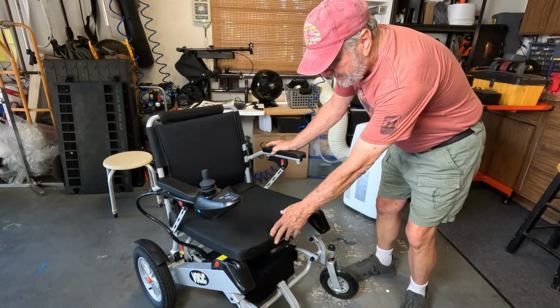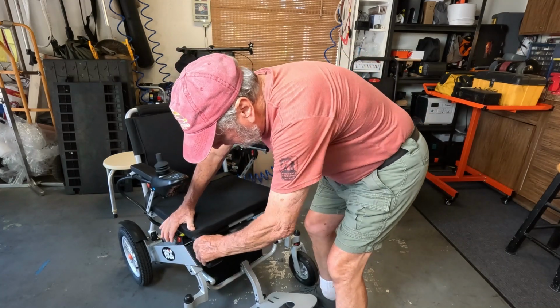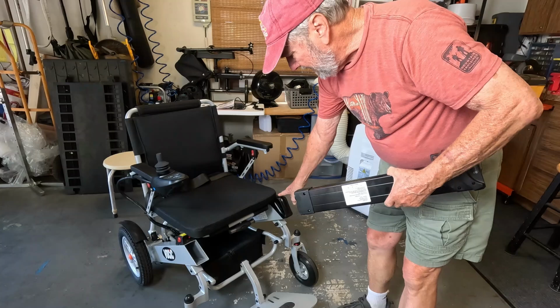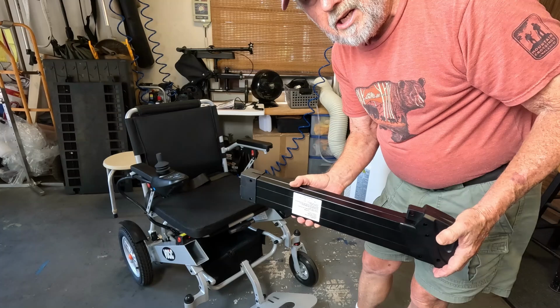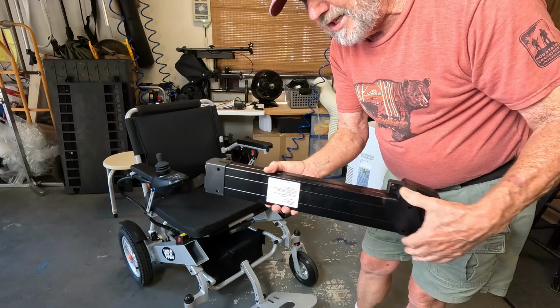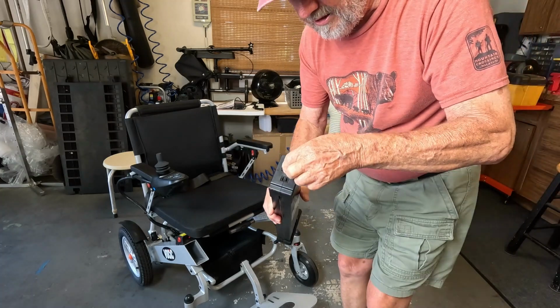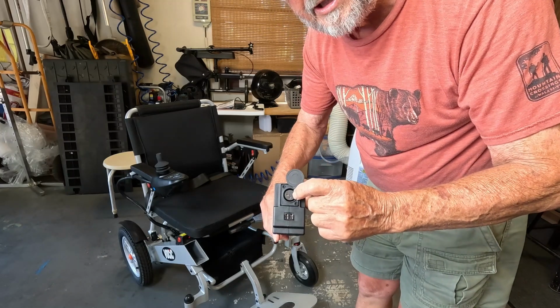Now we're going to look at the battery, and we're going to push this, and then this comes out. Now this is the main battery. These are 10 ampere hour each, and this is the same. They say you can go 20 miles. On one battery you'd go 10 miles, and on the other battery you'd get back on the other 10-mile charge. And right here, this slides, and here's where the charger would go, right in there.